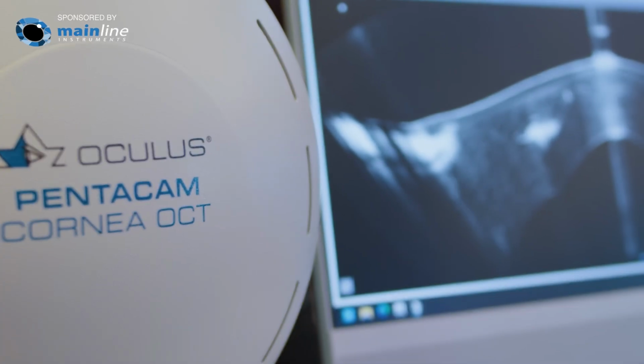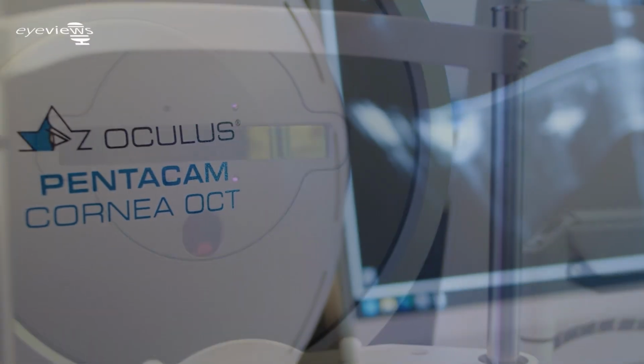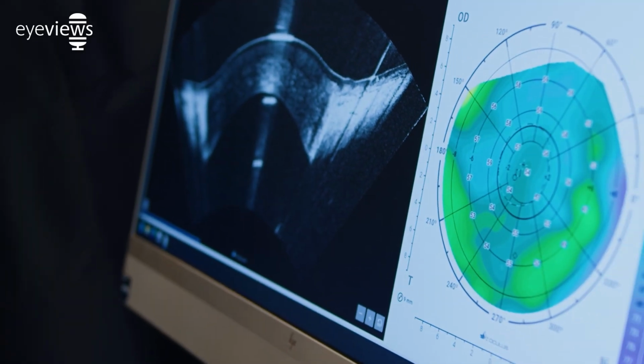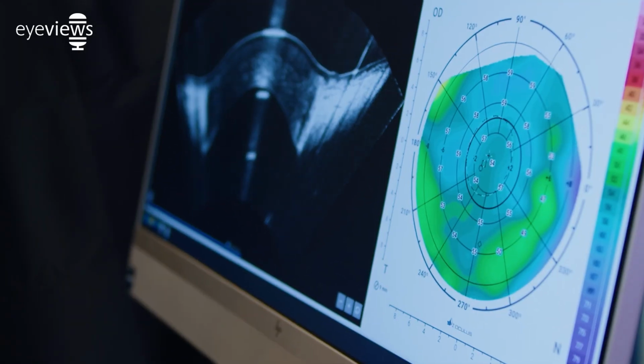The Pentacam scan is always on. The technicians taking Pentacam images are always very busy. There is a long queue. When we started using Pentacam many years ago, the Pentacam was a diagnostic device dedicated mostly to cornea anterior topography. But now the Pentacam is used for the full examination of the anterior segment.